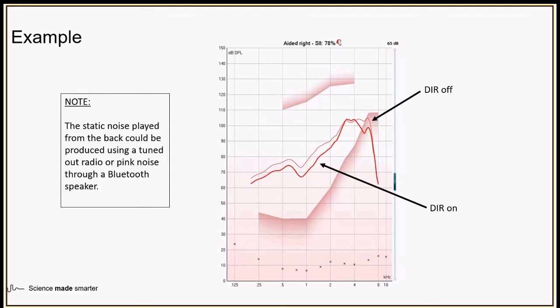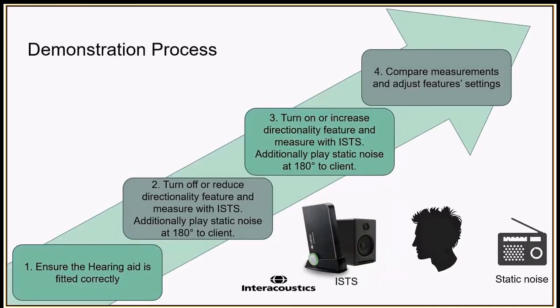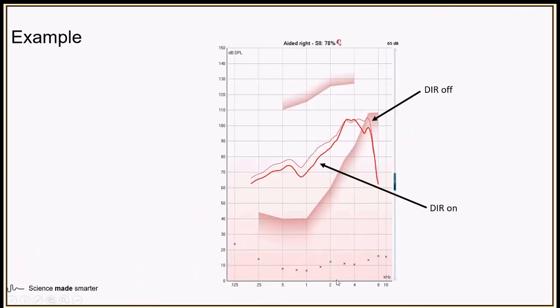Now, I found a pink noise track on YouTube, and it was quite easy to play that through this small speaker from the back of the patient. So it was easy to recreate this environment. It's really crucial that you have the same conditions for measurement 2 here and measurement 3 with the feature on and off, to allow you to compare the two together.